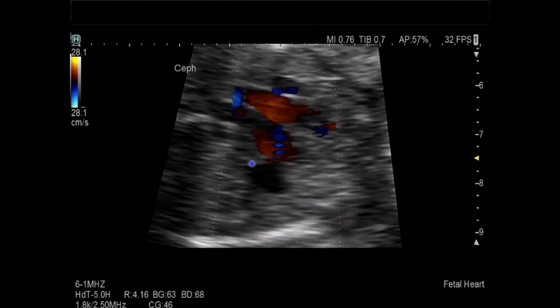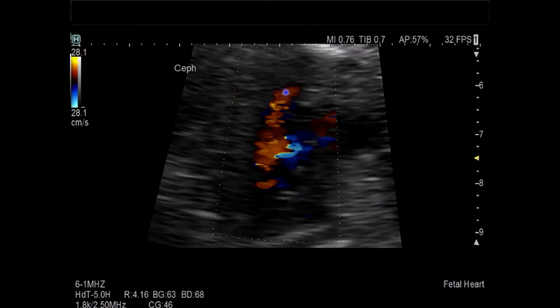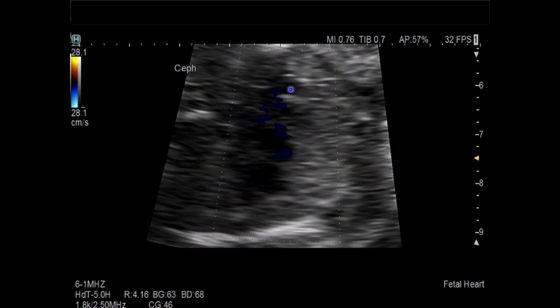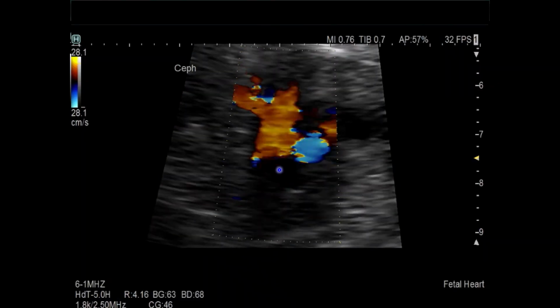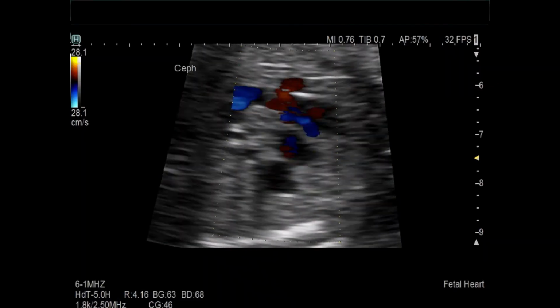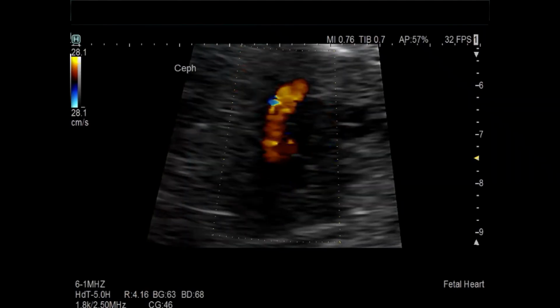a pulmonary vein confluence behind the left atrium, which drains to this left-sided ascending vein that then drains to the innominate vein and drains to the SVC. And so that's a great pickup in this view if you can see this.